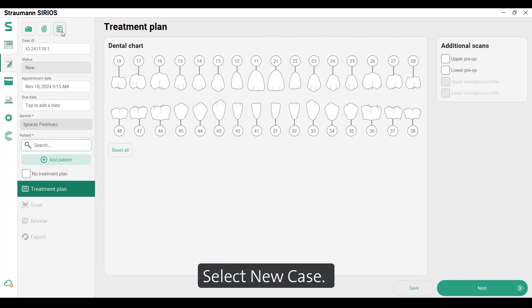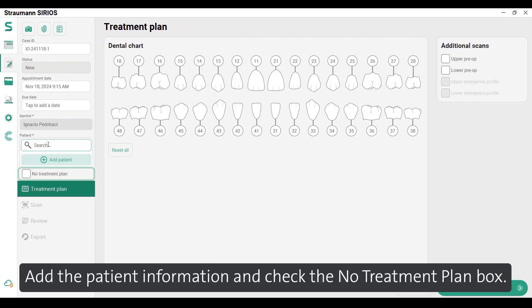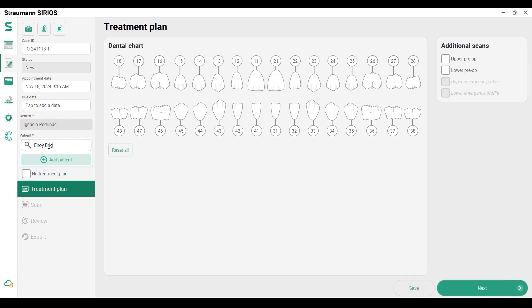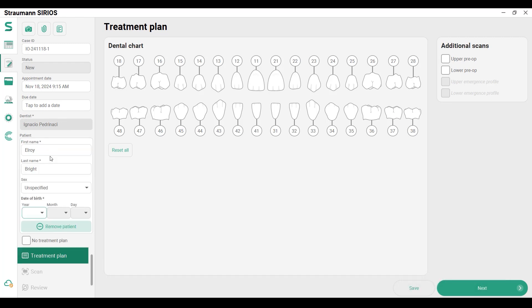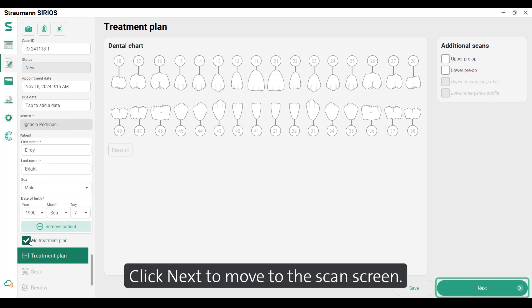Select New Case. Add the patient information and check the No Treatment Plan box. Click Next to move to the Scan screen.